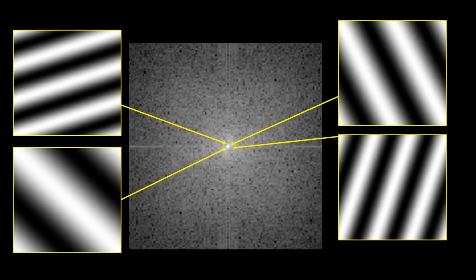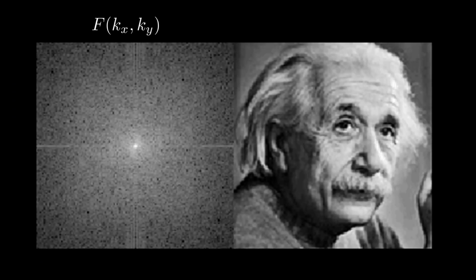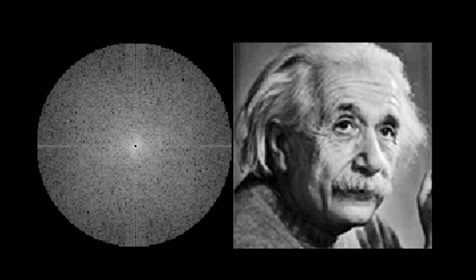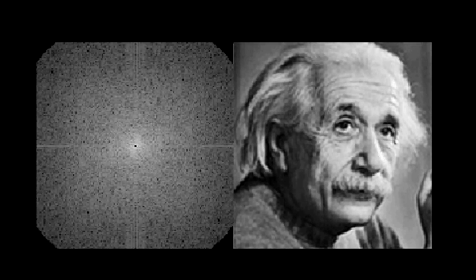Now the center of k-space contains low frequency sinusoids, and thus information regarding gradual changes in intensity are largely contained here. Conversely, the high frequency information closer to the Nyquist edges forms the sharper changes in intensity and is thus more responsible for fine details within the image. In an image you can see that if we remove high frequency information of k-space, the image lacks fine detail, but gradual variations are maintained. Conversely, if we remove the low frequencies near the center of k-space, the image lacks signal and contrast, but the fine details remain. These would be low and high pass filters, respectively.